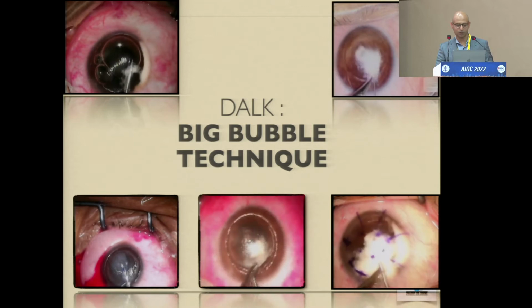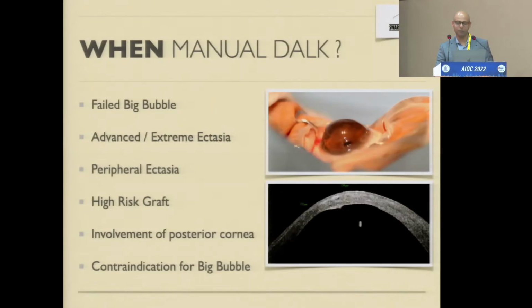So this was already shown. So ideally we would like a big bubble in every case, and it's a very nice technique. But there are problems with big bubble. You don't get it all the time. Sometimes you can end up with perforations and other complications. You may end up with a type 2 bubble, which can sometimes be disastrous.